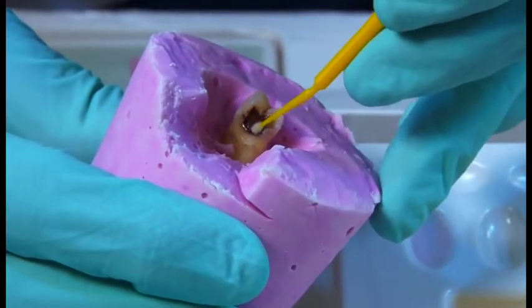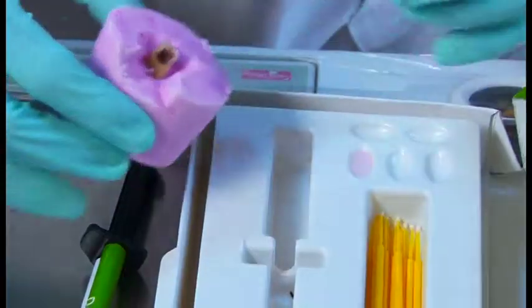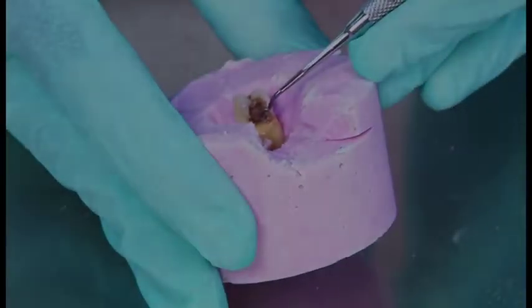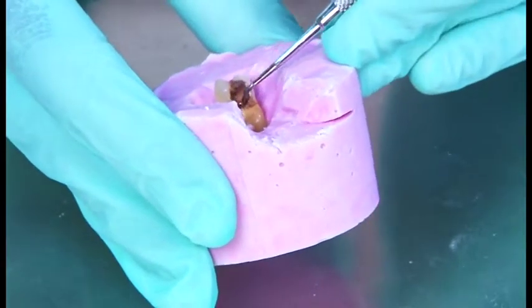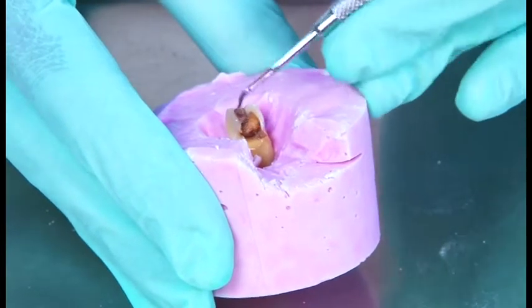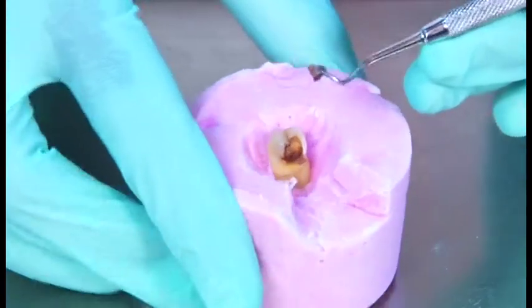2 to 3 applications into the soft caries, and leave it like this for 30 seconds. Now, all you have to do is with the excavator, scoop the soft caries. It comes off very nicely like this.